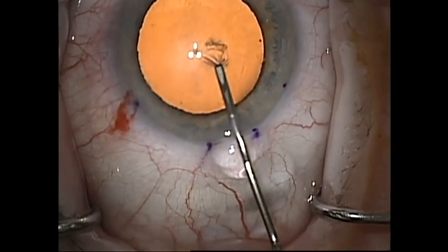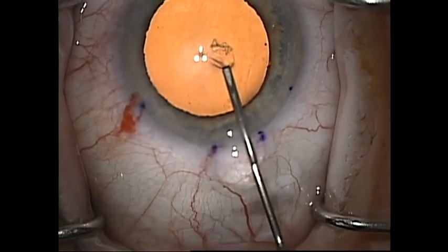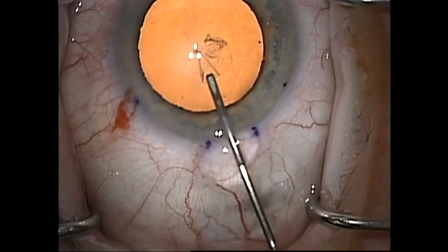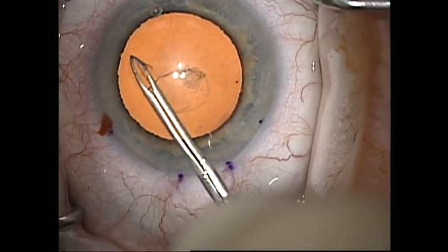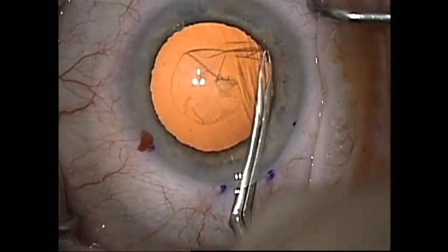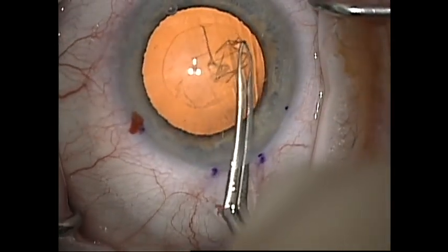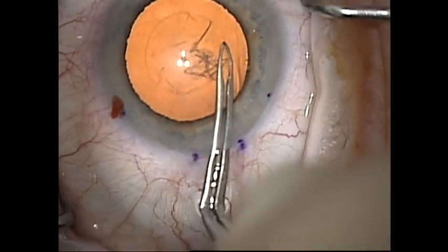The cataract surgery proceeds with the usual technique. The only modifications are that the capsulorhexis should be a little smaller than normal to maintain stability of the intraocular lens during the DMEC portion of the surgery. Additionally, it is important to only use cohesive viscoelastic in your cataract surgery, as dispersive viscoelastic will interfere with the attachment of the graft.